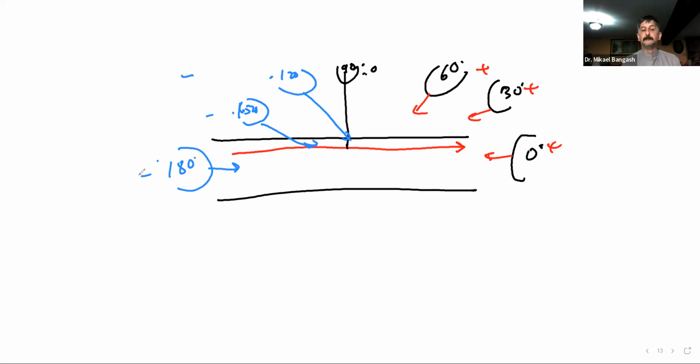Did you girls get that? But if we take the same transducer and change the direction in which the blood flows, now the blood flows here like this. In that instance, if you scan from here, that's going to be 180 degrees.